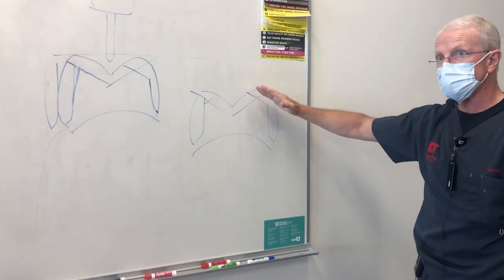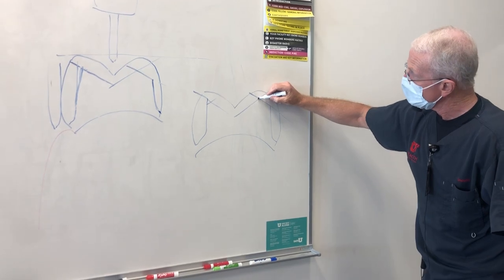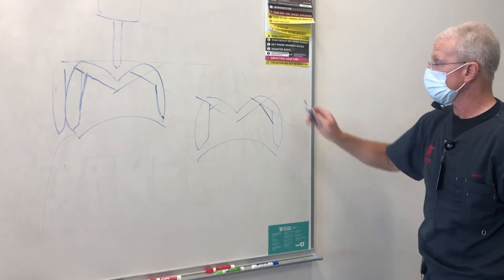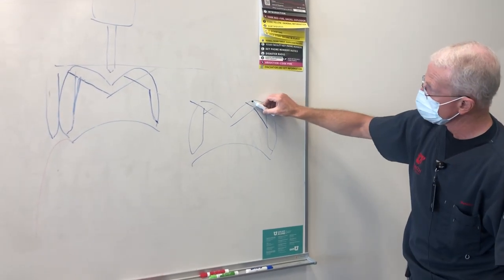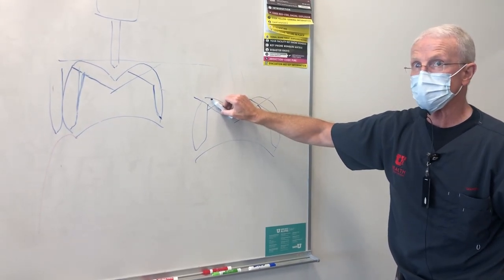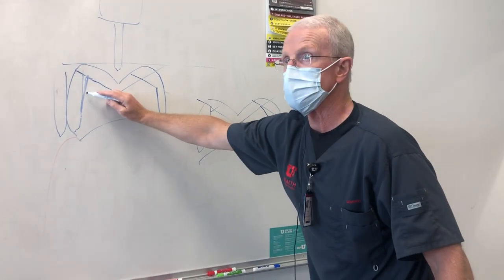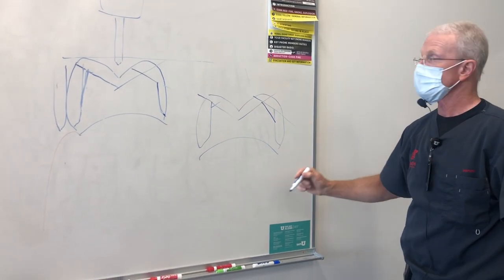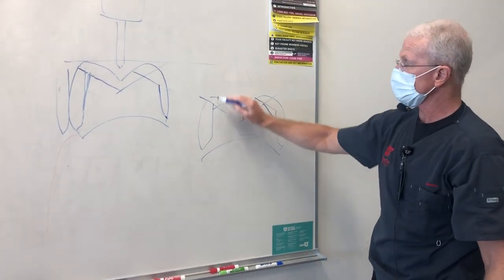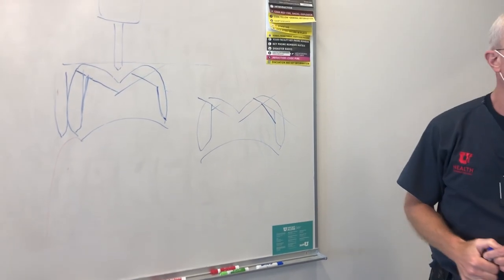The further anterior you go in the mouth, into the premolar area, the functional cusp bevel gets steeper to accommodate for that. But in the molar region, it's exactly the same angle as your non-functional cusp bevel. As you go towards the premolars, it gets steeper. And the linguals of those lower molars are so straight, you don't need to do that in two planes. Gotcha. Okay, those are all really good questions.